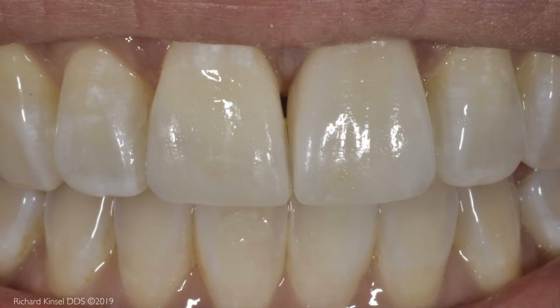This is the final result. Note that the all-ceramic crown on the right has the color and internal characterizations that harmonize with the patient's natural teeth. The edge of the partial porcelain veneer on the left is not discernible.